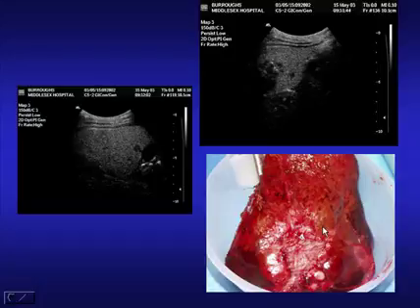This has always been the reasoning behind the surgical dictum that if you excise a colorectal cancer metastasis, you must take at least a centimeter of normal tissue as a safety margin so that you gather in these often microscopic satellite tumors. And we know that CT and MRI are not very good at picking up sub-centimeter lesions because the inherent contrast is insufficiently great.